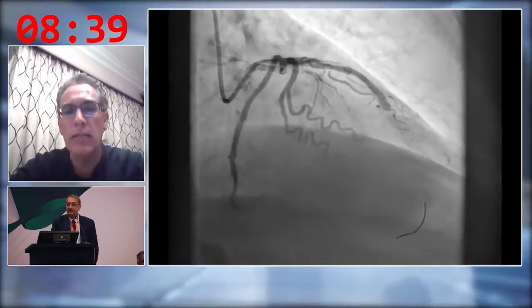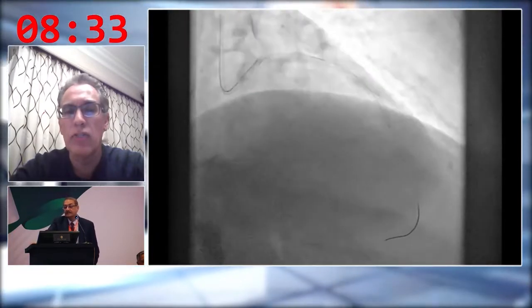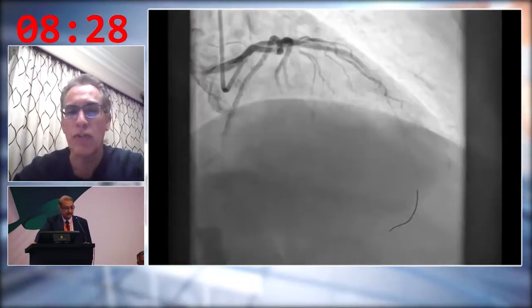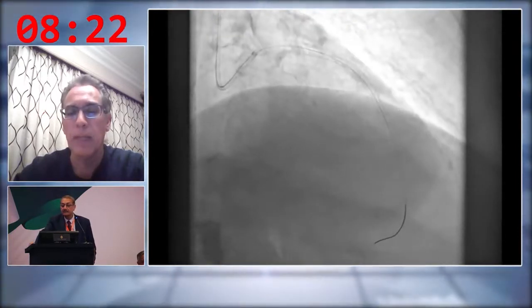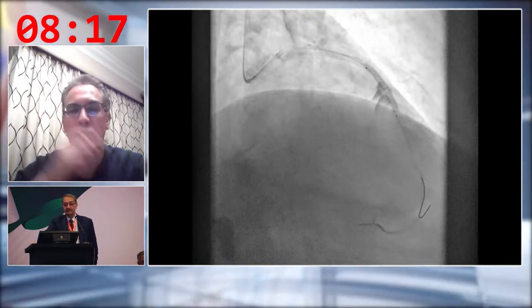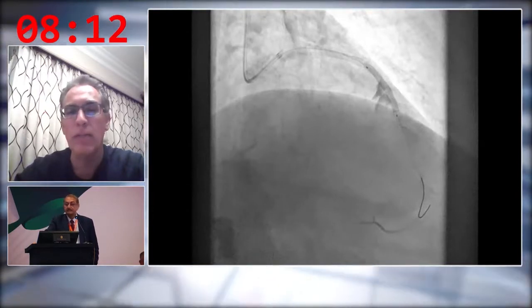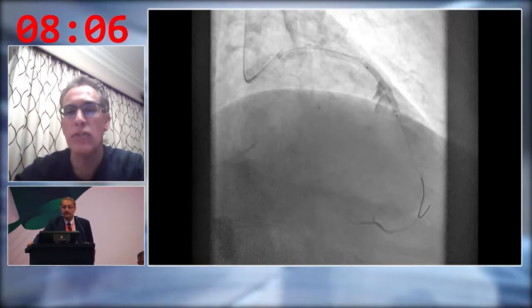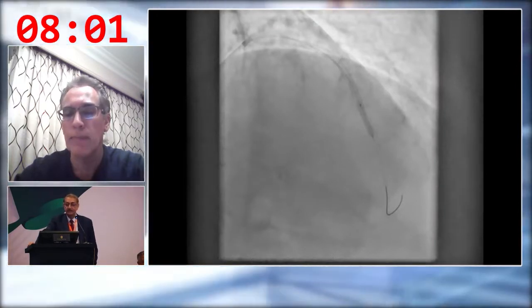What you can see is that right around the site of the distal stent, there's a dilation and slow flow. As soon as you see this, you need to recognize that this could be a potential perforation, which it was in this case, and there's no flow down the LAD. We balloon tamponaded it. By the time we did that, you can see the perforation has extended. We covered that with a 3.0 by 20 millimeter Papyrus covered stent. There was a distal edge dissection, which we covered with a small drug-eluting stent.